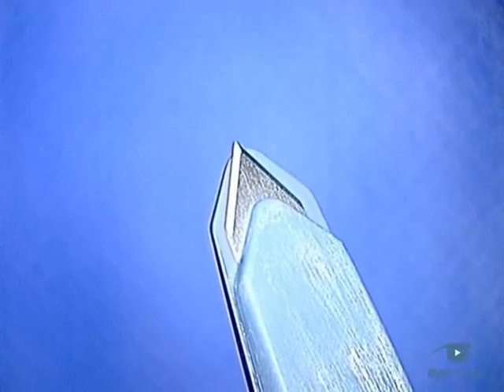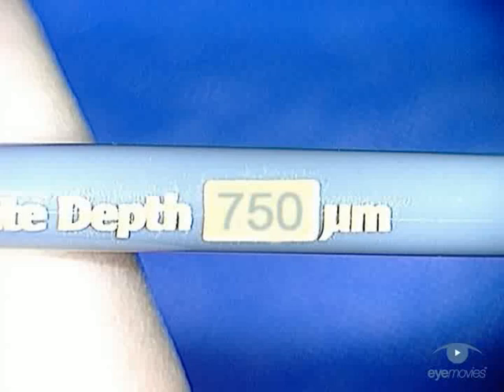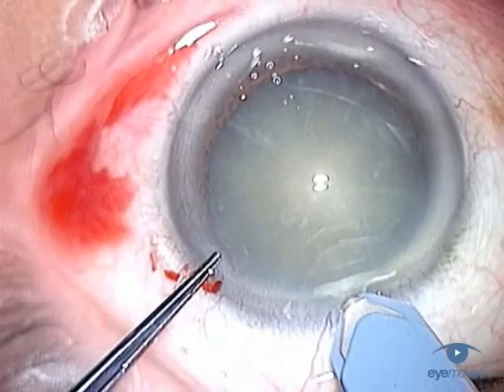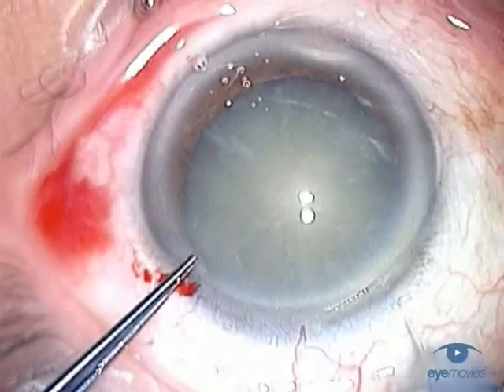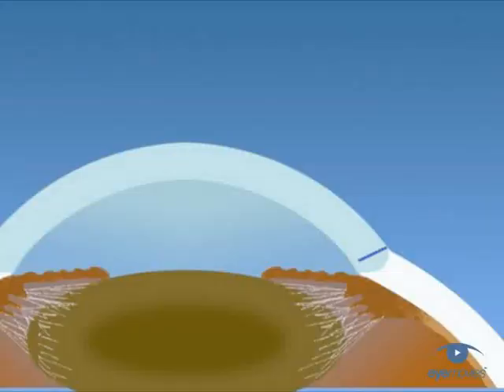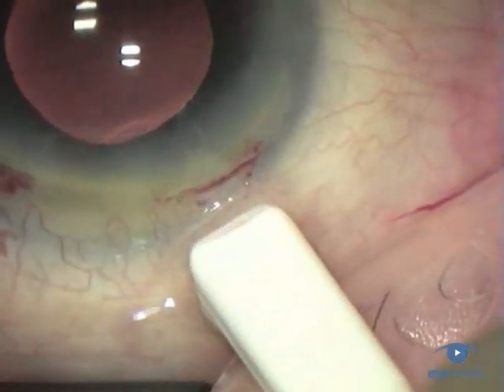There is one particular triplanar incision that's worthy of mention on its own, and that's the hinged incision described by Langermann in 1994. He designed a three-step clear corneal incision with a deep pre-groove of 750 microns. The tunnel was made about halfway down this groove. The aim of this was to create a hinge effect that would encourage closure of the tunnel floor against the roof. This produces a wound that's watertight even to pressure applied to the back edge of the incision.